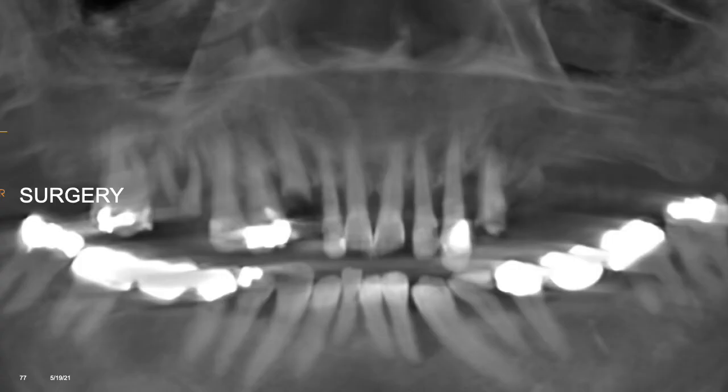These are the patients you're going to see. Perio-involved, multiple caries. They're trying to save their teeth, but it's not the best case to restore with individual crowns. So the first thing you have to understand is, I'm going to give you two examples of an upper arch, to see just how far these cases go.